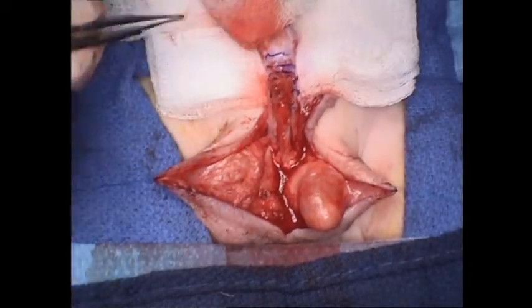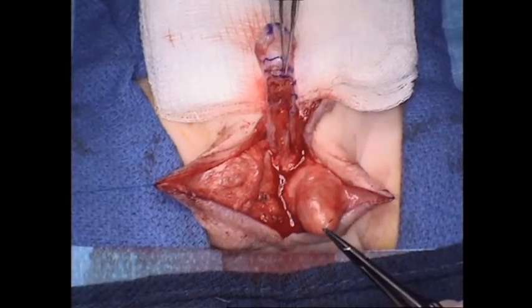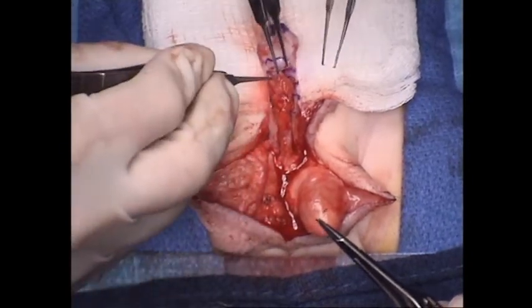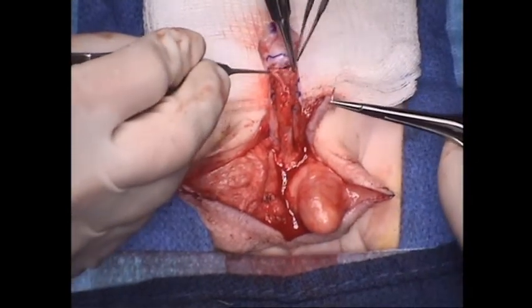Okay, 7-0 micro. So we're going to put the urethrostomy onto this isthmus here between the most distal and the middle corporotomy.